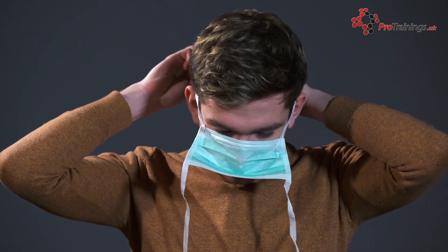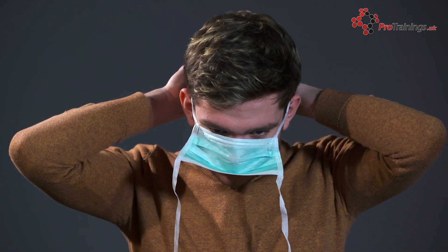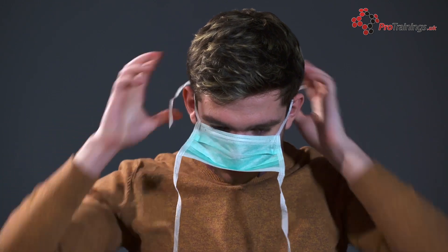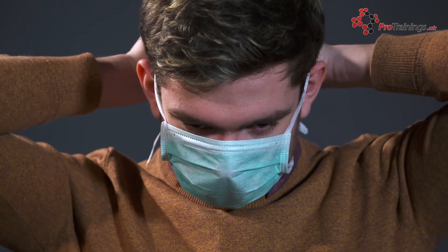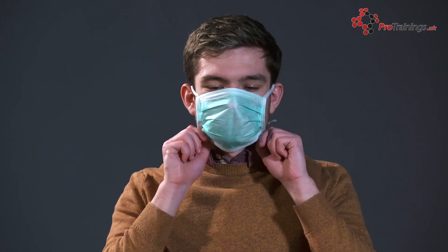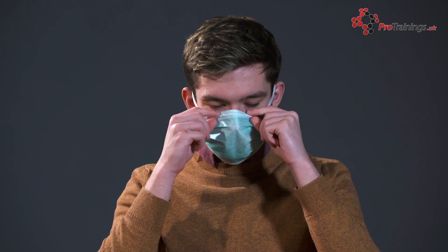If the mask has ties or straps, secure the top one and then the lower one at the base of your skull. Adjust the mask and bend the nose bar to fit your face, ensuring that the mask covers under your chin. Whilst wearing a mask, do not touch your face.